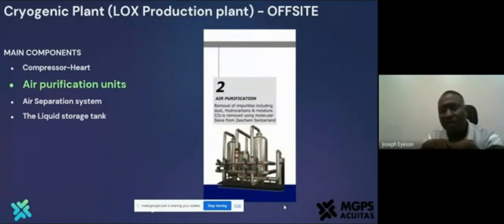But when this compressed air goes into the refrigerant dryer, it drops further, and there is moisture carried along in the air. And this moisture, which is some kind of water deposit, is something that is not good for generation of oxygen. Remember, in our PSA system, moisture can actually spoil the zeolite. So the same principle. The technology is designed so that you need to take out the carbon dioxide, take out the hydrocarbons, and then the moisture.